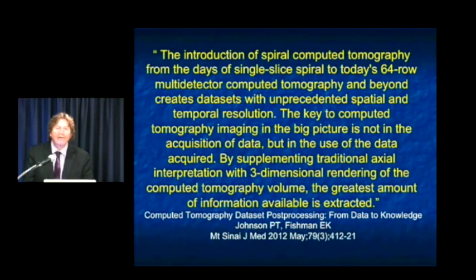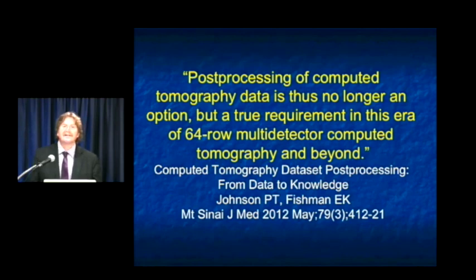There have been a number of articles. This was a couple years ago from Pam Johnson. By supplementing traditional axial interpretation with 3D rendering of the CT volume, the greatest amount of information available is extracted. Post-processing is thus no longer an option, but a true requirement in this era of 64-row multi-detector CT and beyond. And that indeed has been our experience, and that is what we consider.